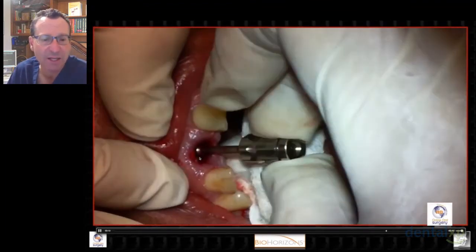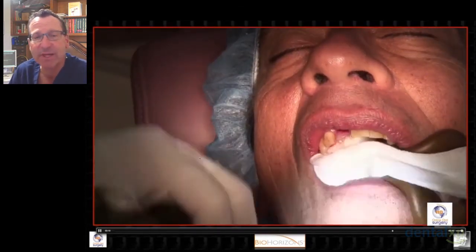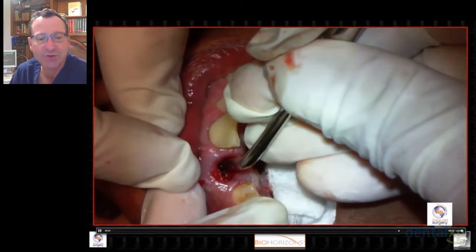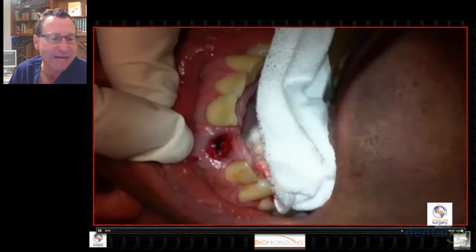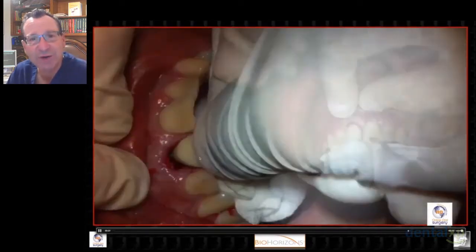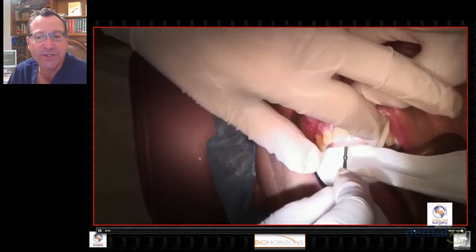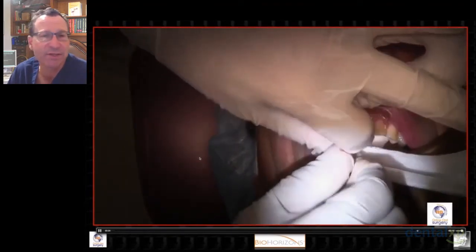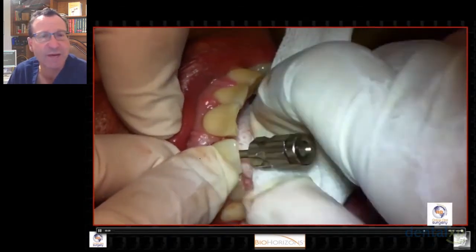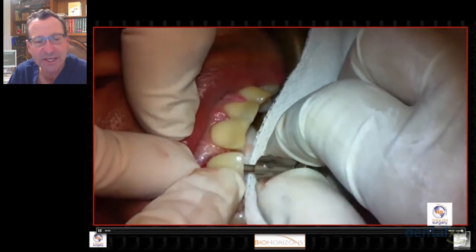the master model. And what you'll see is this prosthesis goes into place basically with no adjustment. It goes right into place. We've got the proper timing of the implant, the proper depth of the implant. So this provisional restoration goes right in, and basically then we just tighten down, put in the abutment screw, tighten it down to 20 Newton centimeters. So we do it by hand first, and then with the torque driver handpiece.